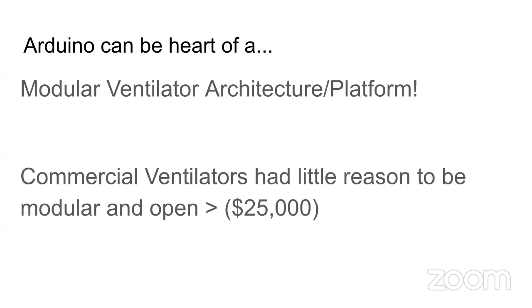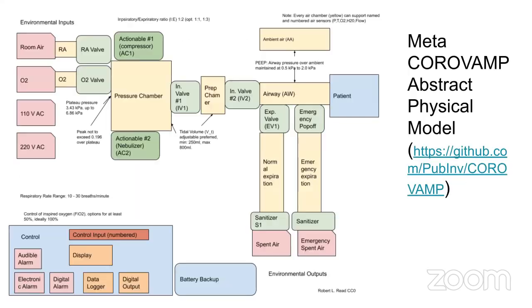So Arduino can be the heart of a modular ventilator architecture platform. Commercial ventilators had little reason to be modular and open. They were selling devices for more than $25,000, and they specifically didn't want to make it modular. Their systems are highly optimized, and no doubt they were very good at what they did. But a modular architecture would allow us to deal with supply chain disruptions.